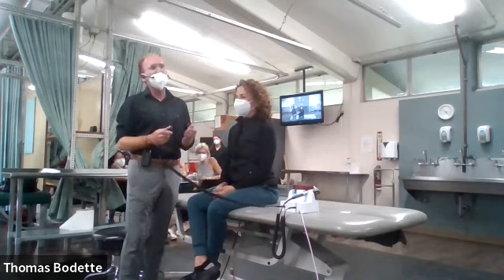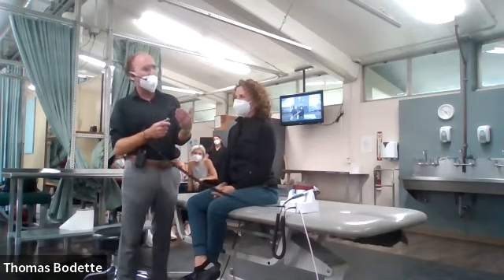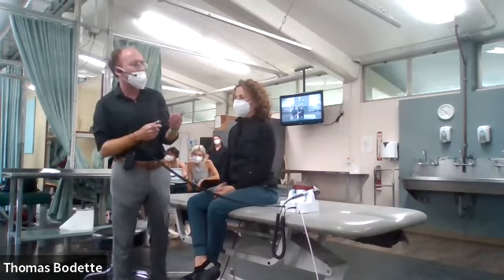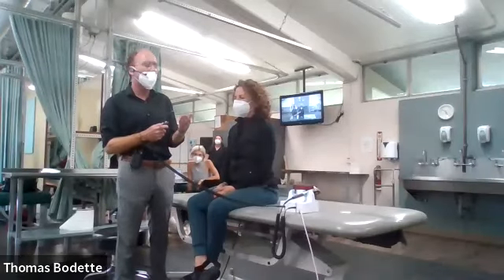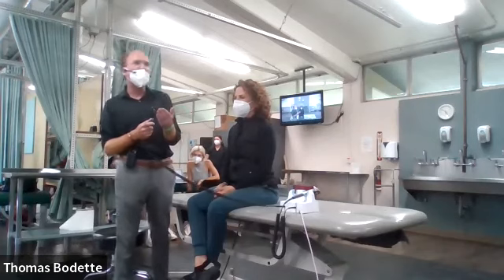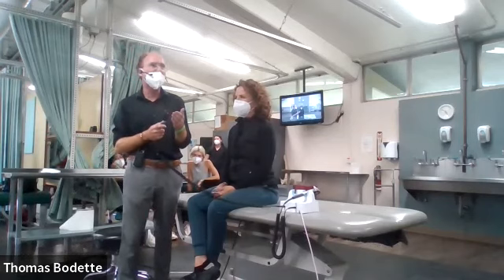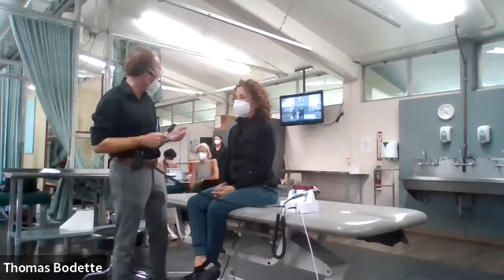All right, so other things you want to consider: if you have multiple settings, I would start with the widest white dot rather than the blue or the slit lamp or the crosshairs on your ophthalmoscope. And also you want to have the intensity of your ophthalmoscope as high as the patient will tolerate. Because if you stay in there a long period of time shining the light, it's going to be very uncomfortable. I saw a few people kind of tearing up a little bit.